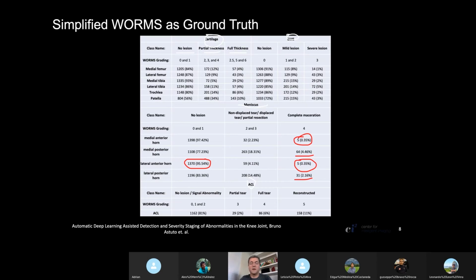Even if we are not sure there is a problem, let's say there is one and run further investigation. In the end, if it's not a problem, then it's okay. We train the models to try to be more sensitive.